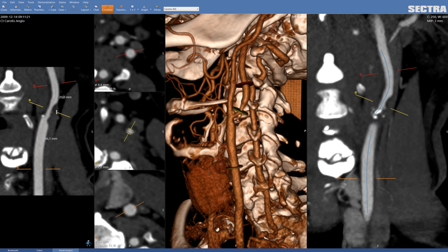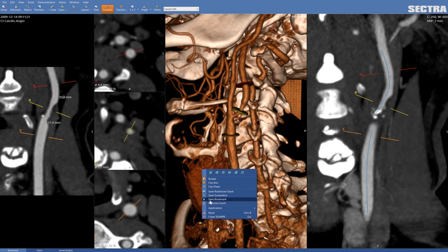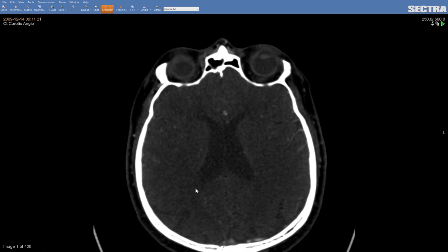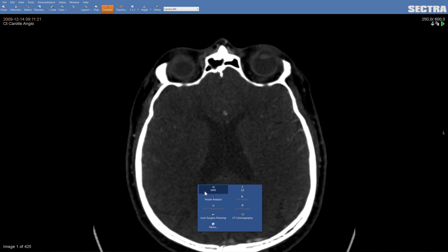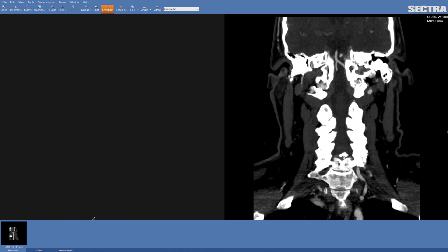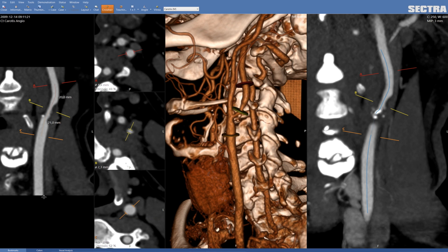If I press the bookmark now, I'm saving all the settings that I have done. So if I right click and close this application, then open it again and open my bookmark, it will automatically open where you left off.